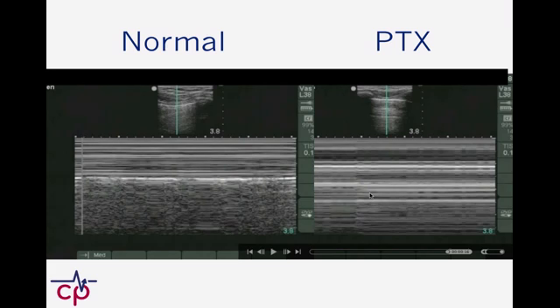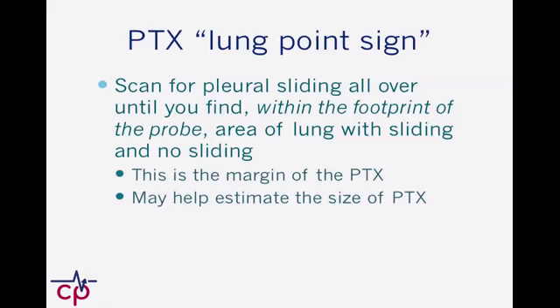See, you didn't really want to know that anyway. I just confused you. But anyway, just think about seashore, good.